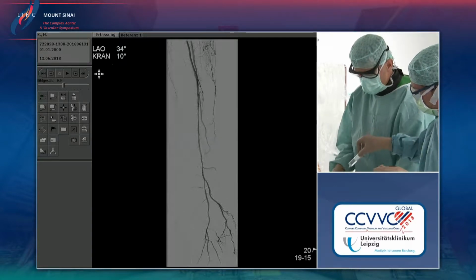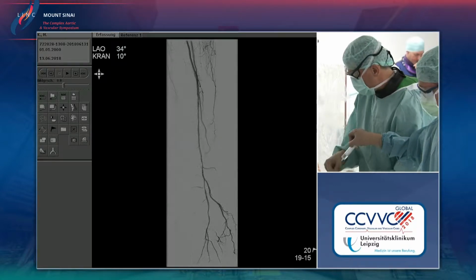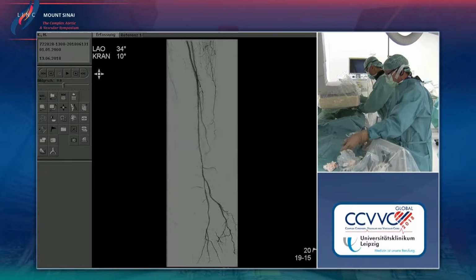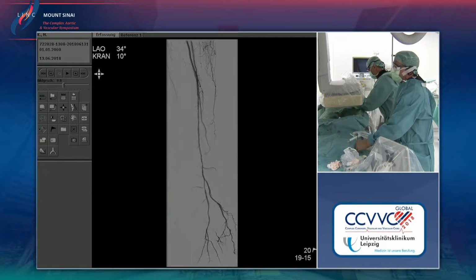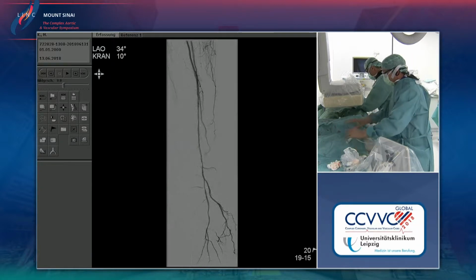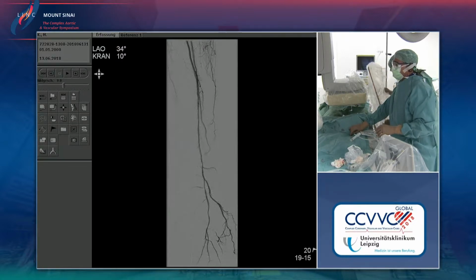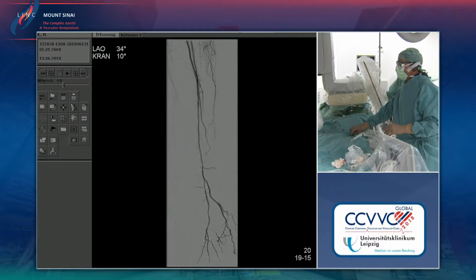Plus, while you do that, ultimately this is kind of a touch-up therapy, if you may, on the way out. So you would have to be comfortable with what it looks like before you put the Bullfrog in on your way out of the procedure. So as is right now, there's still a reason to believe that there's some more work to be done, Andre, so I would agree with you.